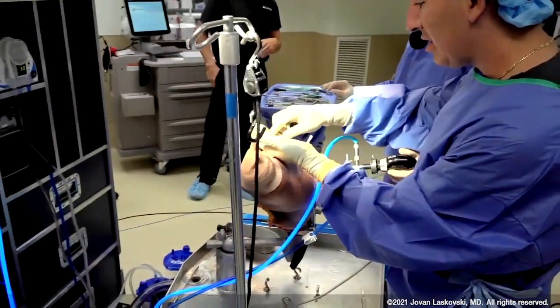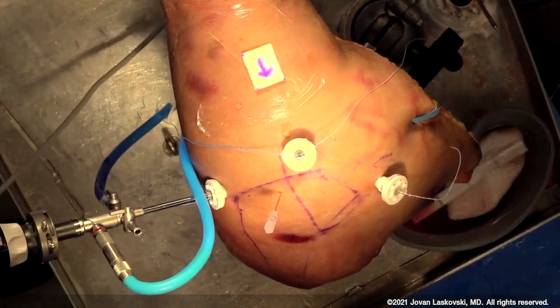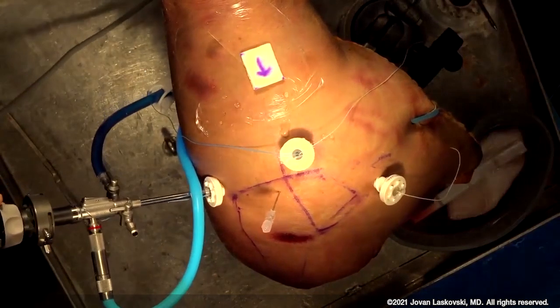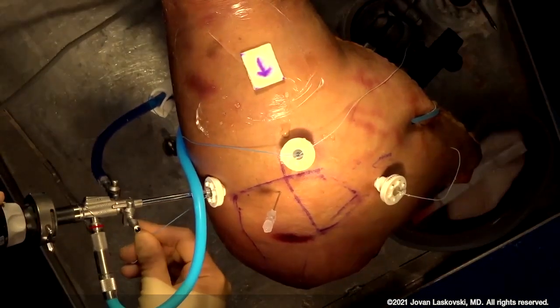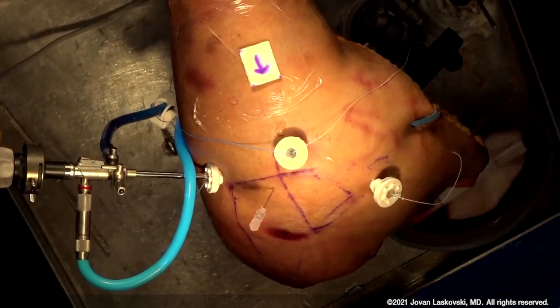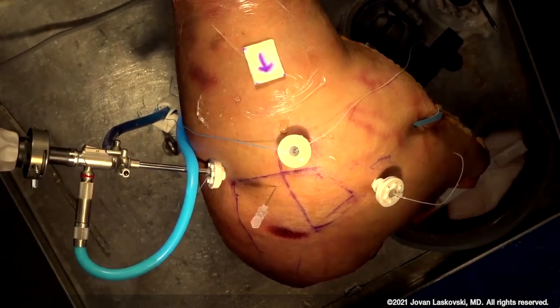We're going to place the graft on our tegaderm and do our measurements. Typically this tends to be trapezoidal in shape. If your infraspinatus is intact, in certain cases it'll actually be either a rectangle or a reverse trapezoid — it all depends on how your footprint looks and what residual cuff tissue is still there. It's important to understand the nuances of the graft itself.